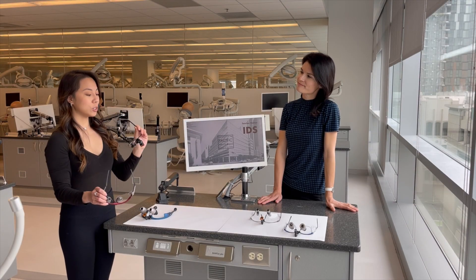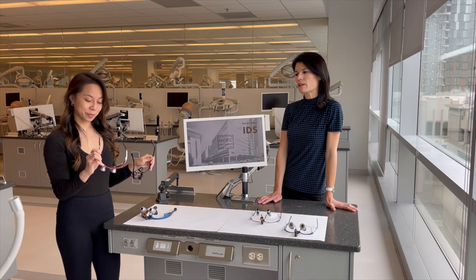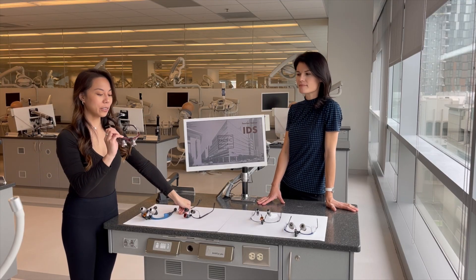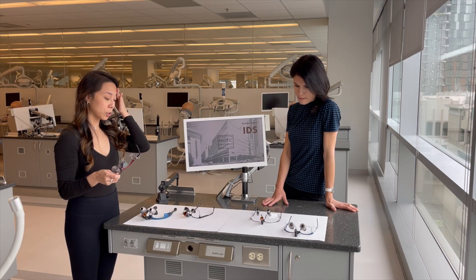Which frames do you think look better on me — do you like these ones or do you like these ones? Well, I kind of like the classic black frame. I really like these red sport frame ones. Well, those look cool too. Which ones are you gonna get? Oh gosh, I have no idea which loops I'm gonna pick.